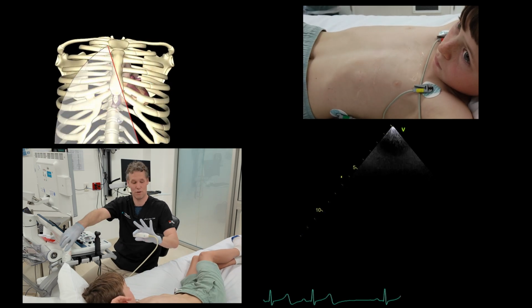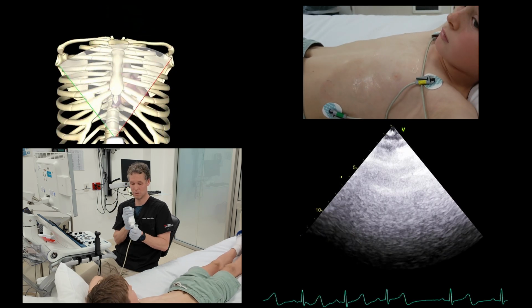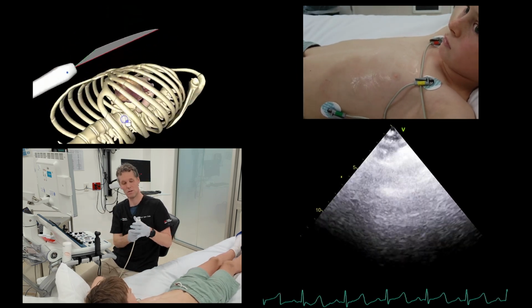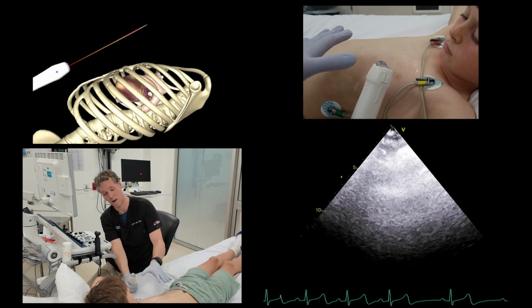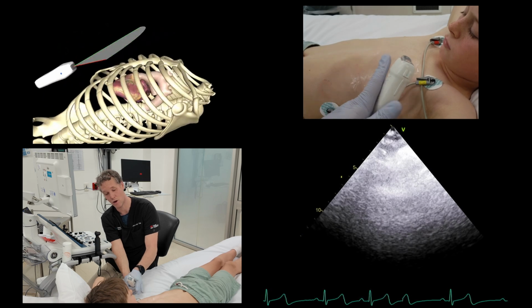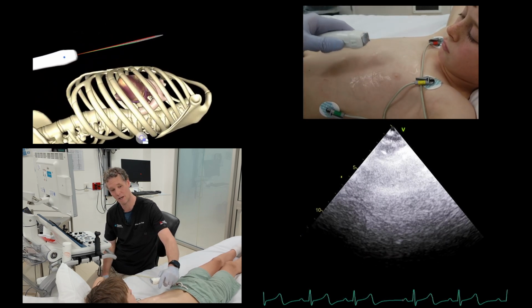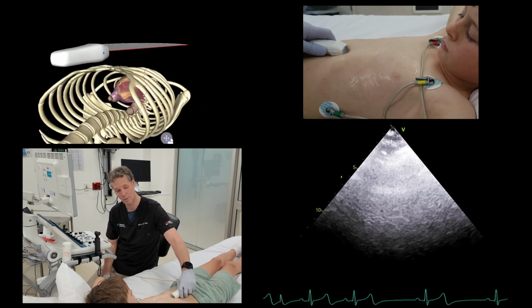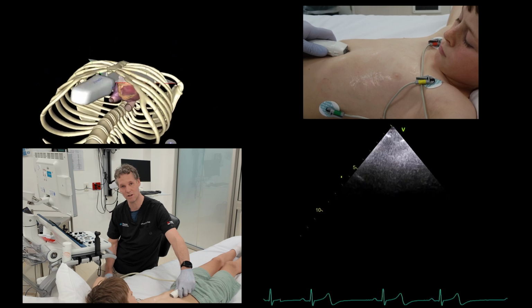Okay, last view is the subcostal. I'm going to hold my probe in a slightly different way. I'm going to have the patient lying flat on their back. I'm going to put my hand over the probe like this so it's nice and flat, and I have the marker pointing towards the patient's left. I press down on the tummy underneath the rib cage at the xiphisternum.